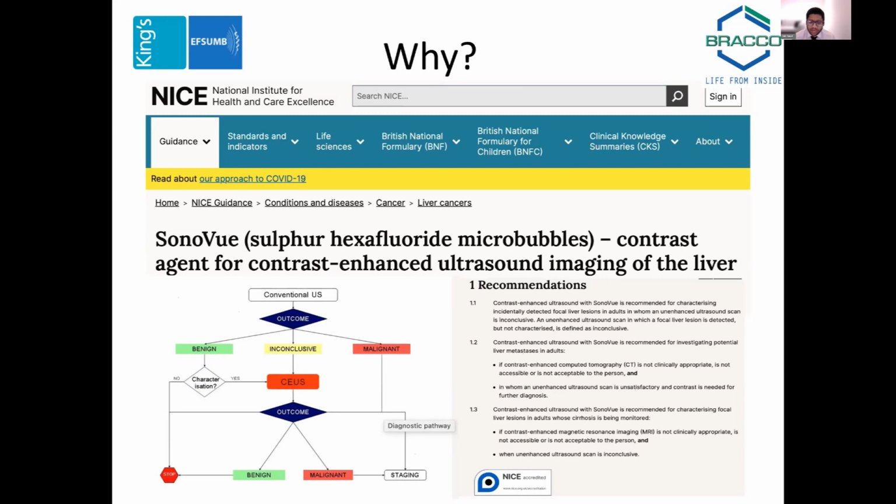So, of course, in that situation, when you have scanned them first, you are seeing a lesion. To be able to characterize it, you've got to be very brave on B mode ultrasound on its own. So adding contrast adds that confidence to your ability to diagnose and may prevent the next steps the patient may have to undergo. Also bear in mind that it is viable as a second line agent as well for those indeterminate cases.